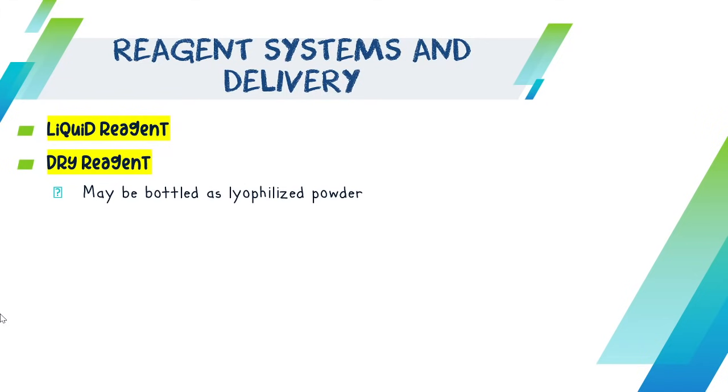So, unsa ni siya? Most of your dry reagents are kumbaga naa sa sulod ay lyophilized powder. It may be bottled as lyophilized na powder. When we say lyophilized powder, freeze-dried siya na powder. And of course, it requires reconstitution with either a water or a buffer.